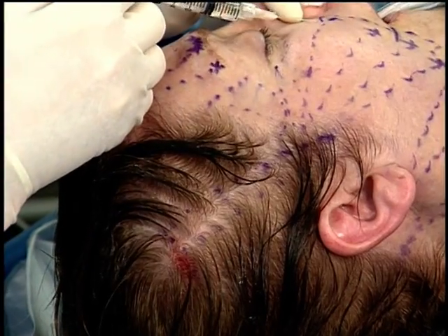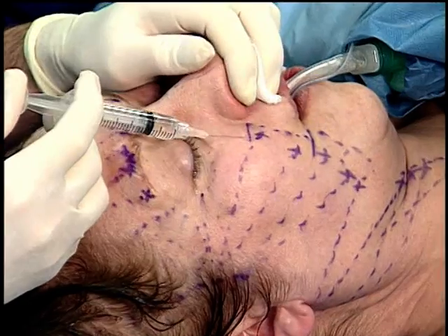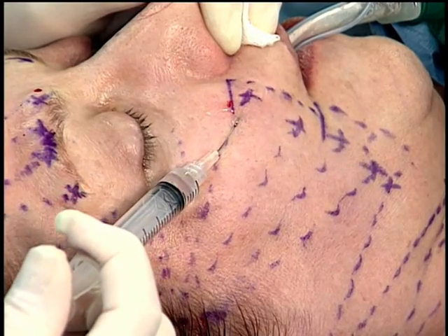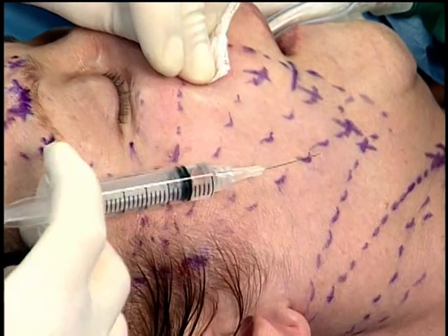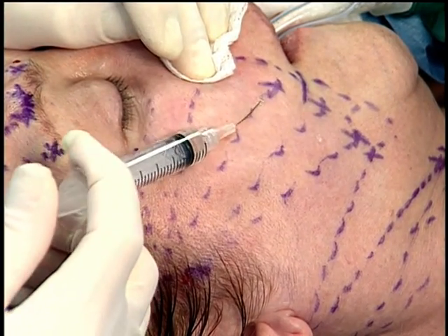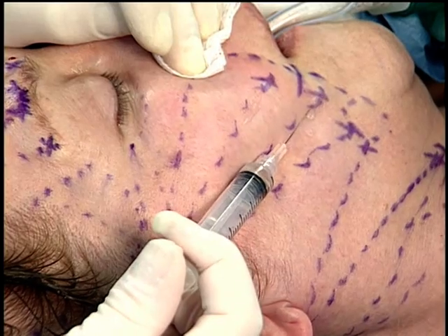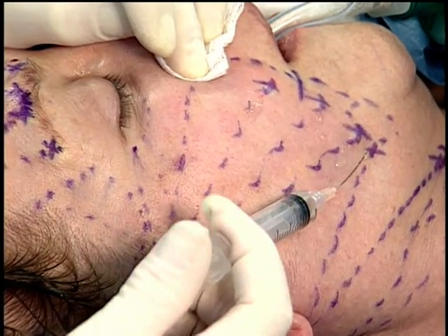All the intradermal points. This is one of the most painful points right here in the V2 distribution. Very painful. I don't tend to do a V2 block because the V2 block will give you a nice above the lip and central cheek anesthesia, but doesn't help you much in the lateral cheek, and you need to do tumescent tunneling anyway. So I don't want to waste my anesthesia on a V2 block. I generally use it for tumescent tunneling. I do all my intradermal anesthesia right up front to get all our exit points nice and numb, nice and anesthetized.